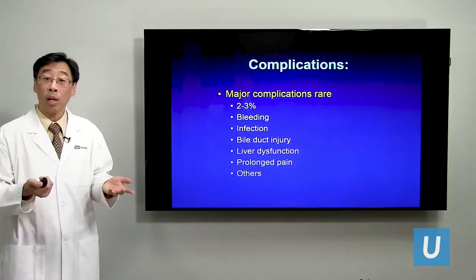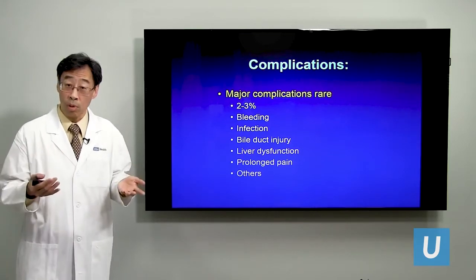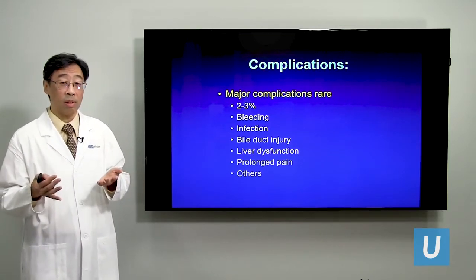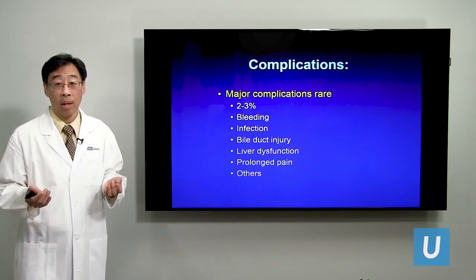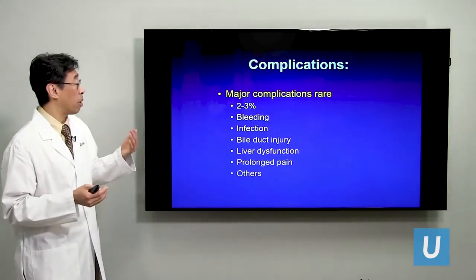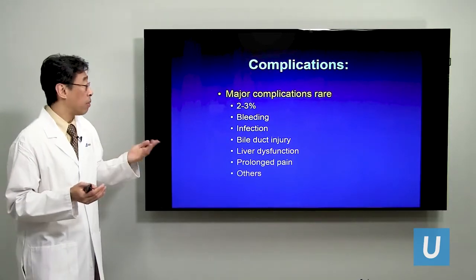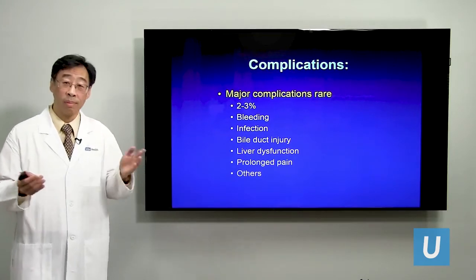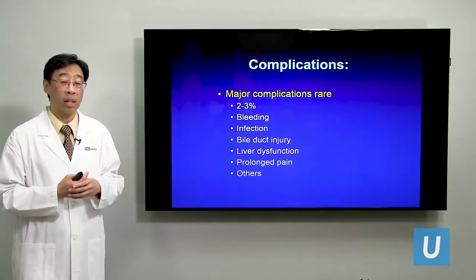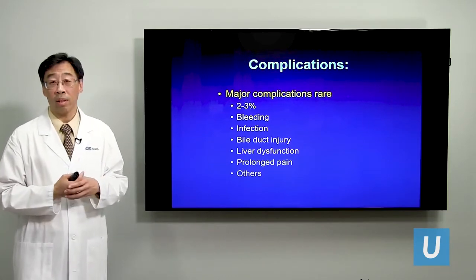In terms of complications, as you can imagine, it is an interventional procedure, so complications are possible, but far, far less than open surgery. And the type of complications that might happen are typically some mild bleeding, maybe infection, and of course we like to avoid all the other injuries, but these are often unexpected and cannot be prevented. And the key point here is that these are rare.